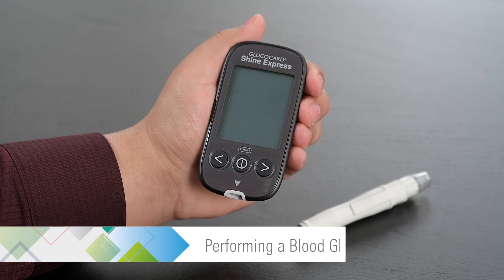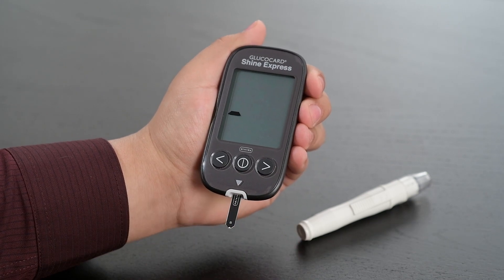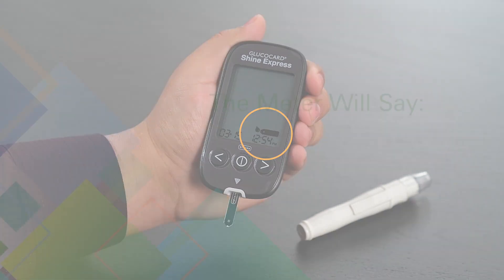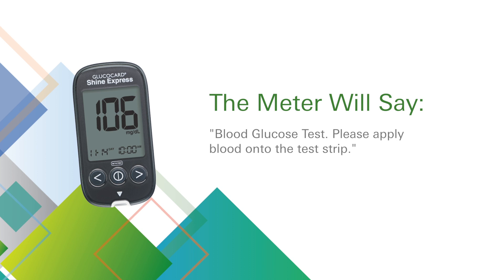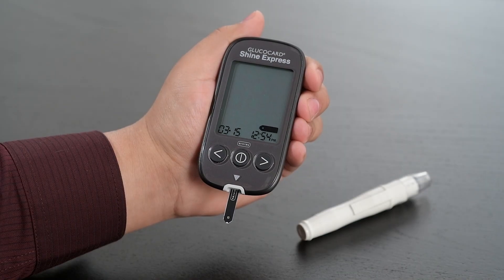Insert a test strip with the insert arrow facing up toward the meter. The apply blood sample symbol will appear, and the meter will say: Blood glucose test. Please apply blood onto the test strip. You are now ready to obtain a blood sample.